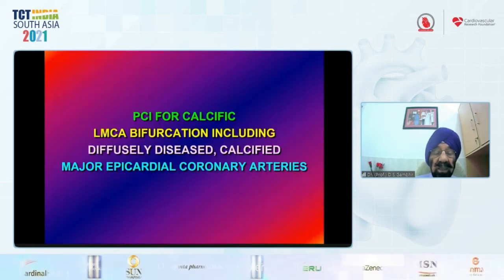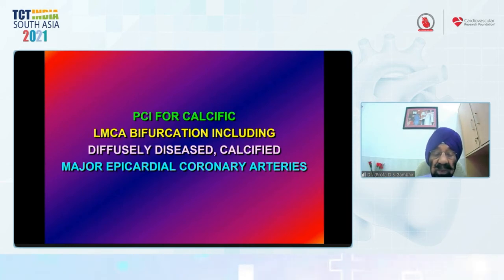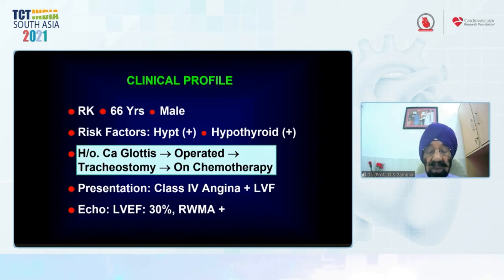And lastly, a highly calcific bifurcation stenosis, which is in a diffusely diseased calcified coronary artery. This is a gentleman who had a carcinoma of the glottis and was operated with tracheostomy. He was on chemotherapy.